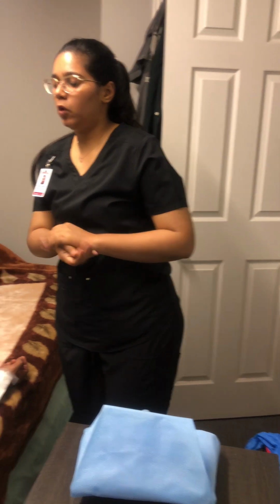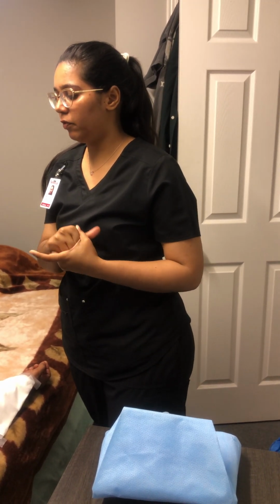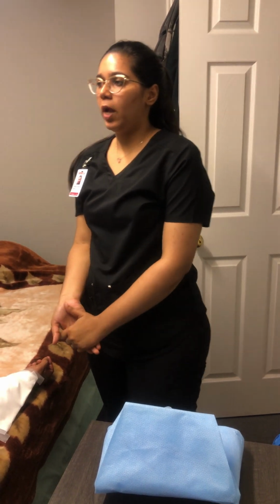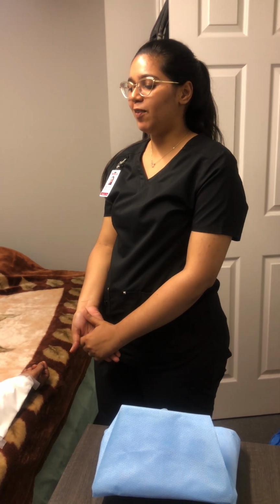I am Rajdeep Kaur, the student nurse of the day, and today I am going to do wound dressing to prevent any further infection in your wound. Moving forward, I need to know two things from you. I am going to assess the pain, 1 being the least, 10 being the most pain. Can you tell me the level of pain?